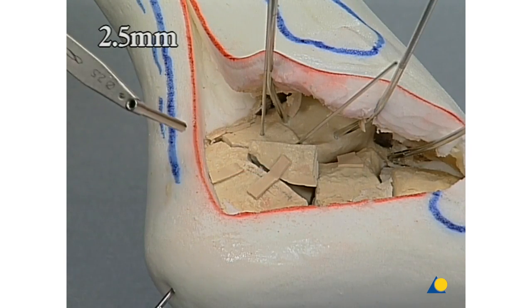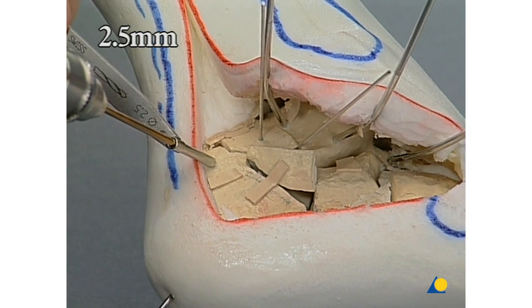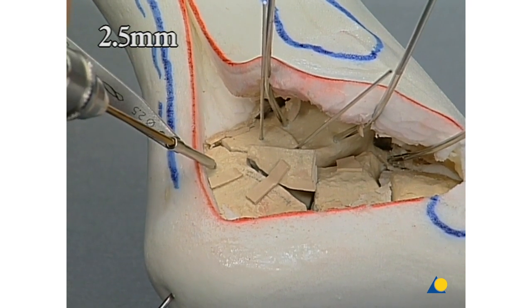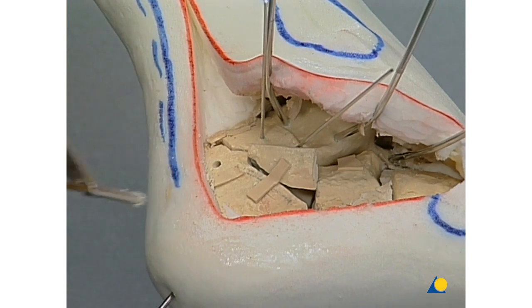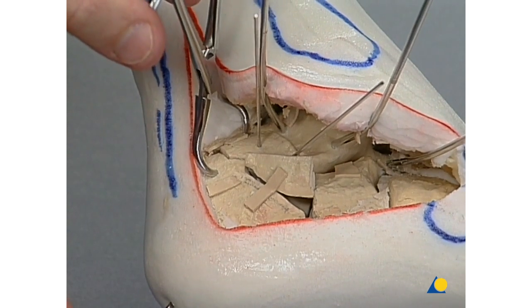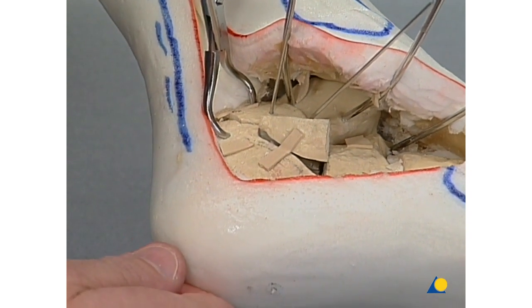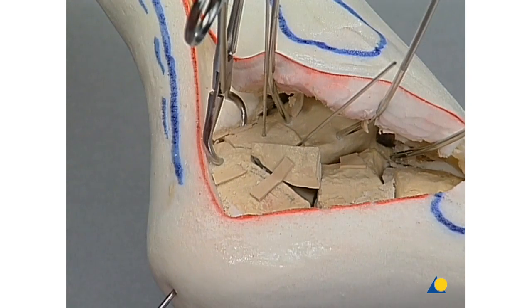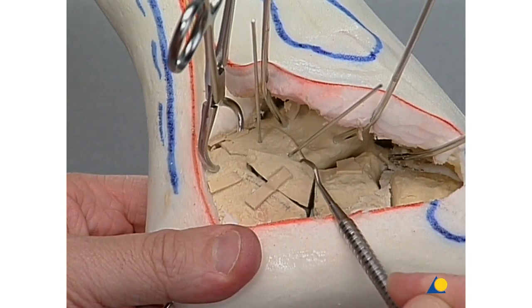For completion of the still unsatisfactory reduction, we drill an additional hole using the 2.5-millimeter drill bit and use the small reduction forceps for minute reduction. Now the last fragment from the posterior portion of the calcaneus is fitted in the lateral wall.